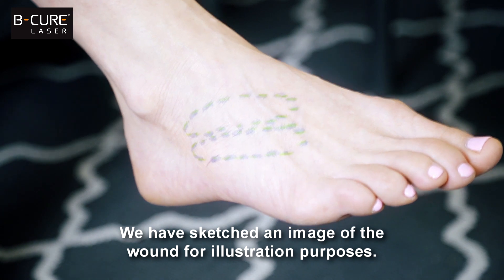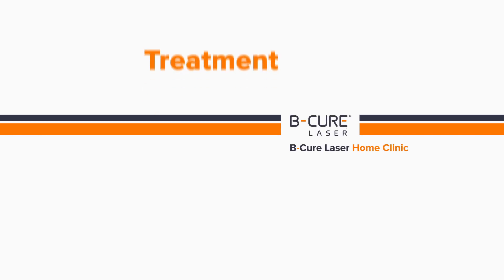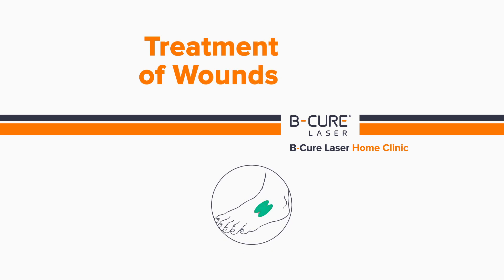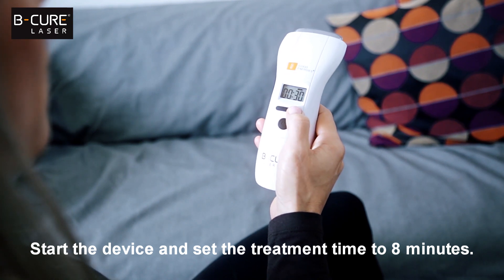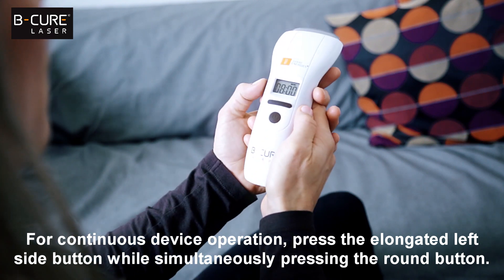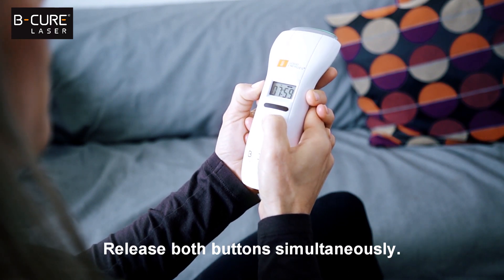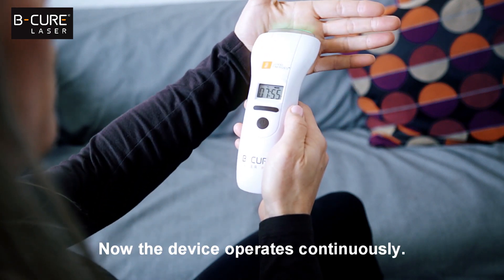We have sketched an image of the wound for illustration purposes. Start the device and set the treatment time to 8 minutes. For continuous device operation, press the elongated left side button while simultaneously pressing the round button. Release both buttons simultaneously. Now the device operates continuously.